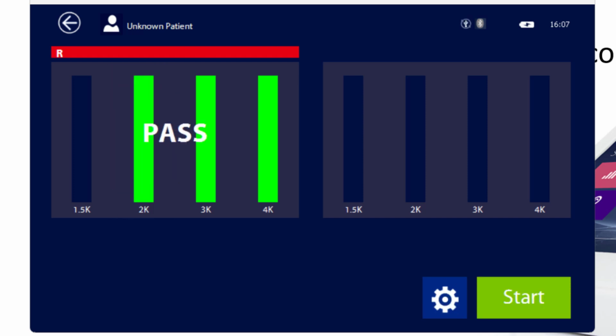And here the test stopped. What you could see during the measurement is that first, in the beginning, we do a calibration, making sure that the probe is properly placed, and then also correct the intensities of the presented tones so that it matches with the ear canal volume that's in my ear.